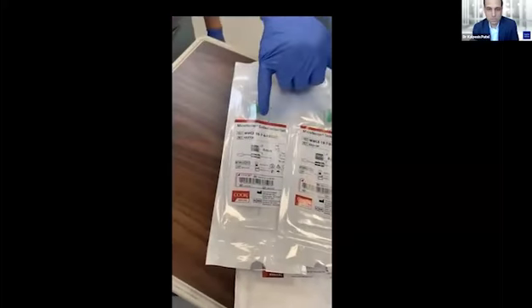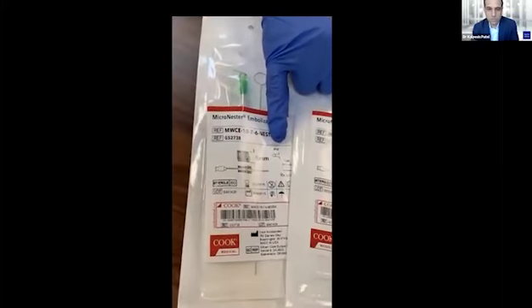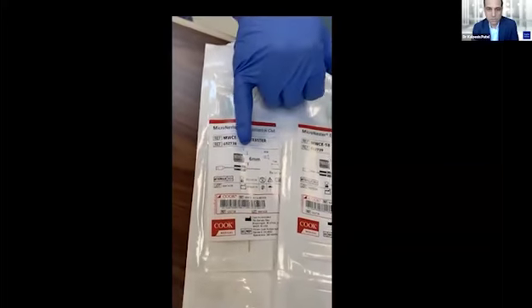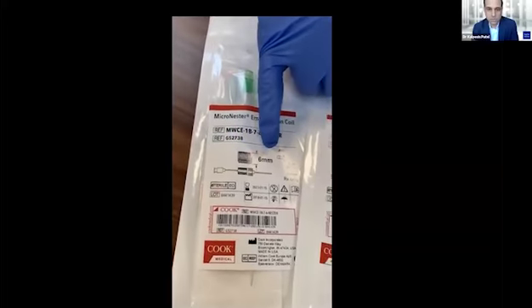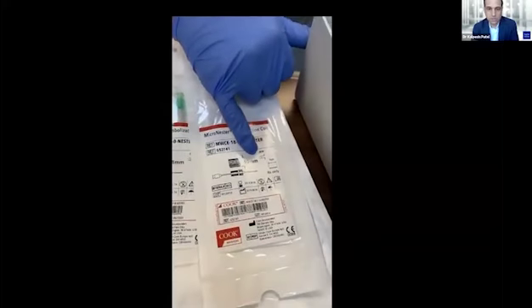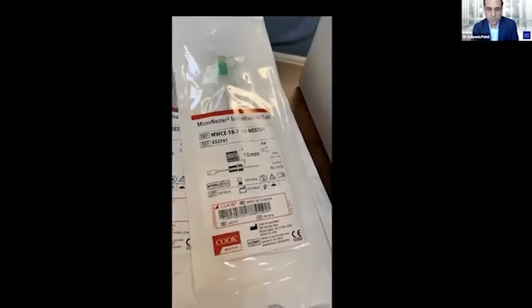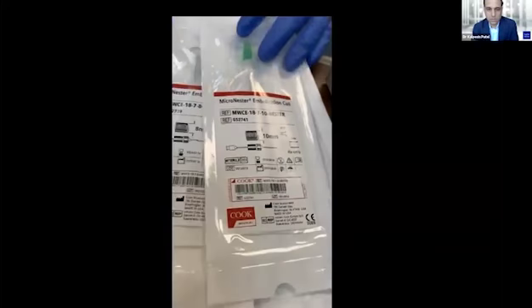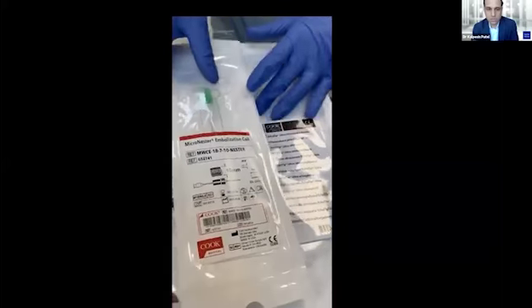And the features of the coil to look at is the diameter of the coil wire. In this case, we're using 0.018 diameter. We also want to look at the diameter of the deployed coil once it comes out. And here you can see it varies between 6, 8, and 10 millimeters. And then finally, the length of the unraveled coil is listed here. In this case, we're using 7 centimeter coils. As I shared earlier, they come in a variety of configurations of these sizes.